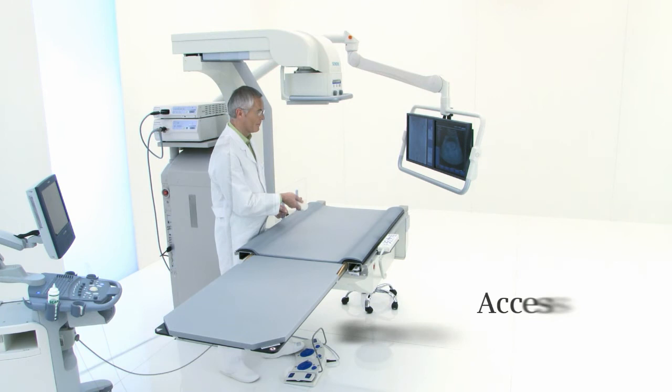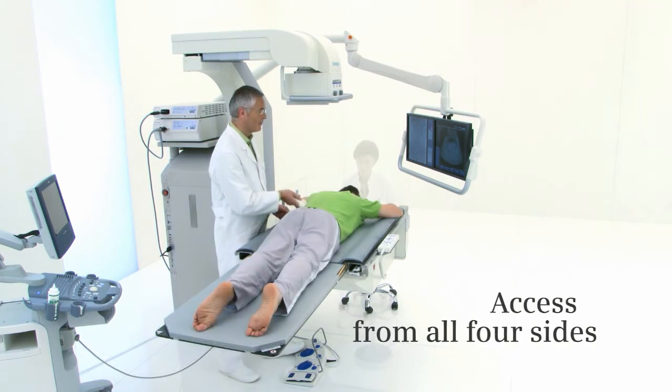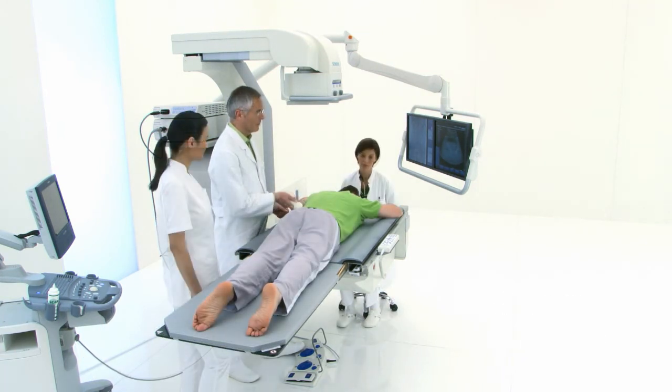you will experience free patient access from all four sides. This is particularly important for lateral percutaneous cases.